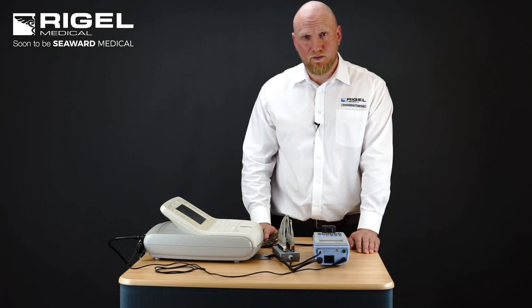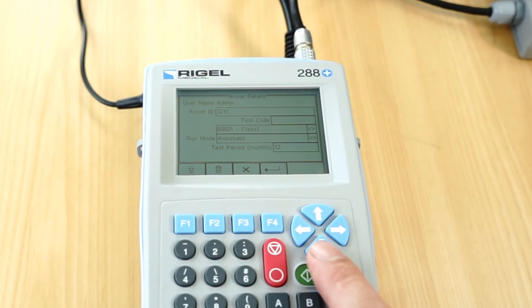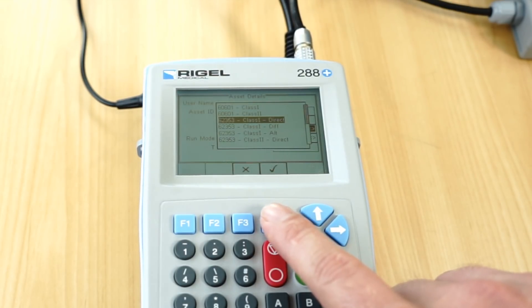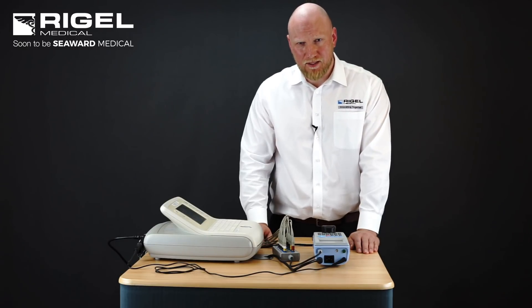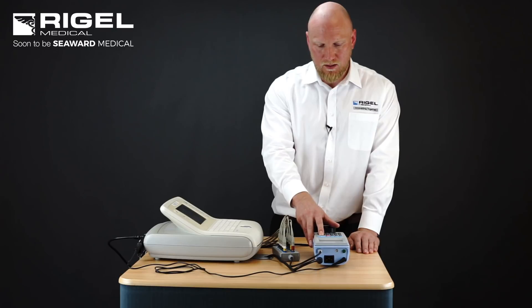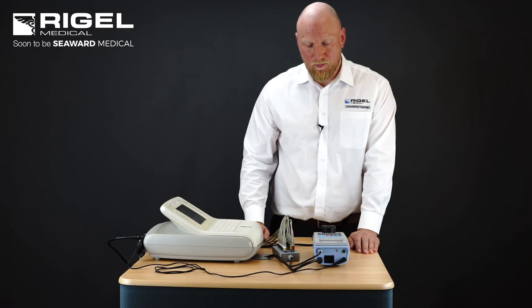Now we're going to do the IEC 62353 test sequence. Again, we will select F4, enter the asset ID, and select the classification. For the purpose of this testing I will select Class 1 Direct Method Leakage. The direct method leakage is comparable to IEC 60601 leakage tests. The run mode I'm going to leave as automatic, the test period I'm going to leave at 12 months, and I'm going to leave the default CF 10 applied parts.